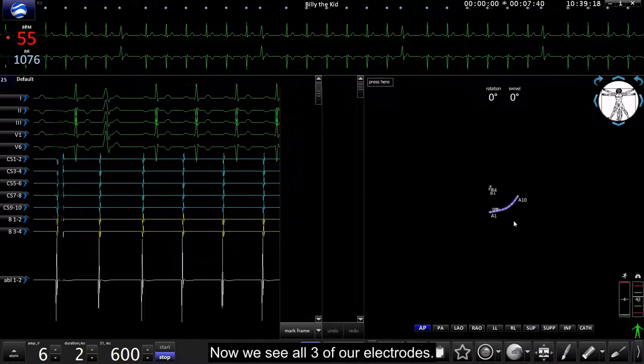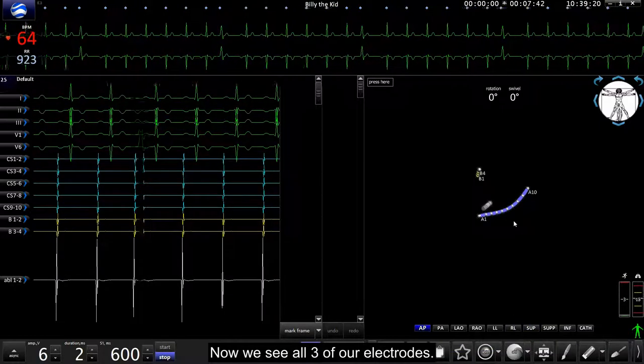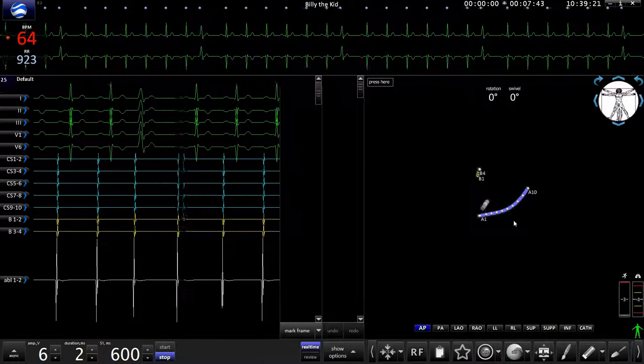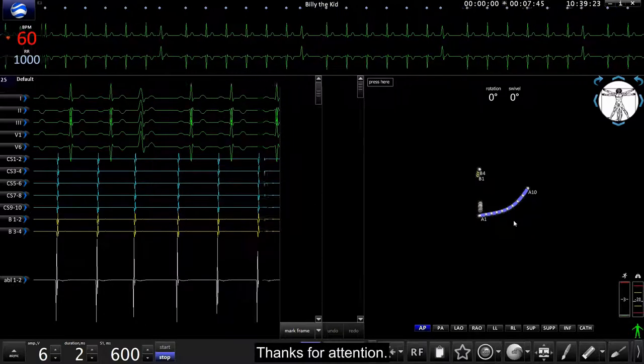Now we see all three of our electrodes. That's all. Thanks for attention.